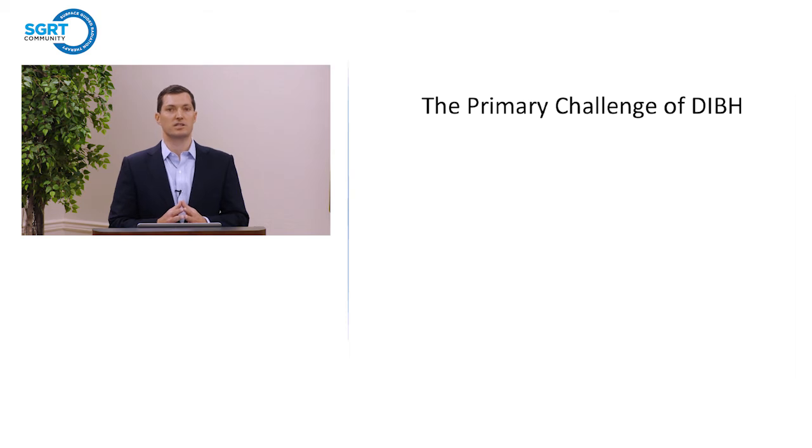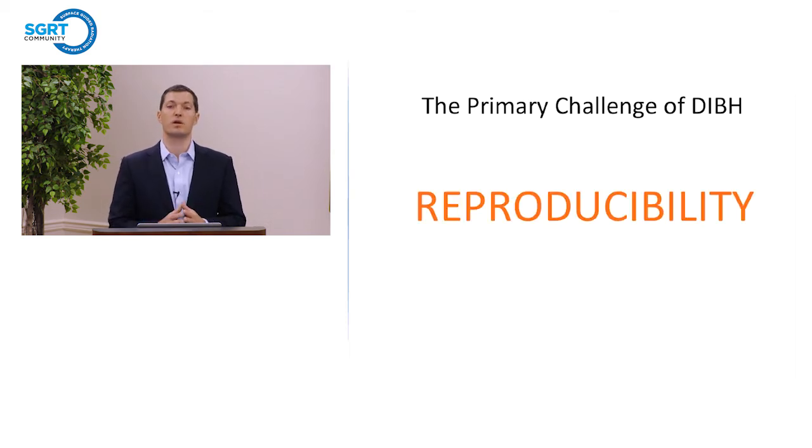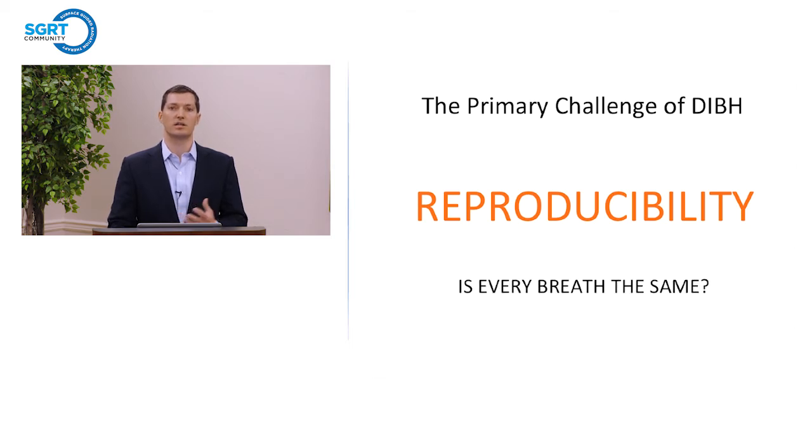The primary challenge of deep inspiration breath hold, however, is the question of reproducibility. In other words, how do we know that the patient is taking the same breath every time? And verifying the reproducibility of a deep inspiration breath hold is where AlignRT comes in.